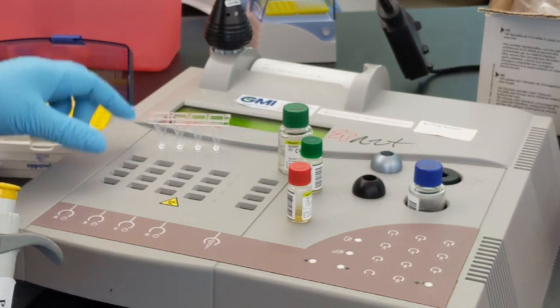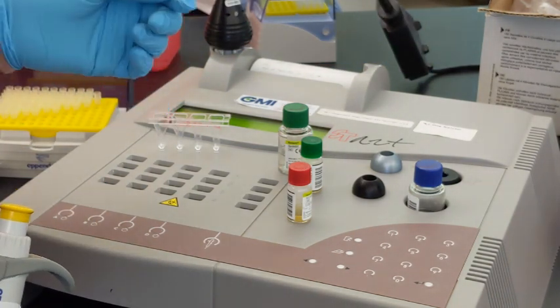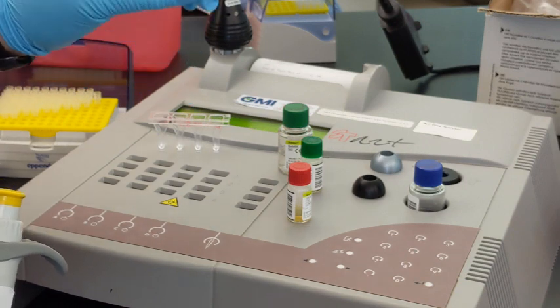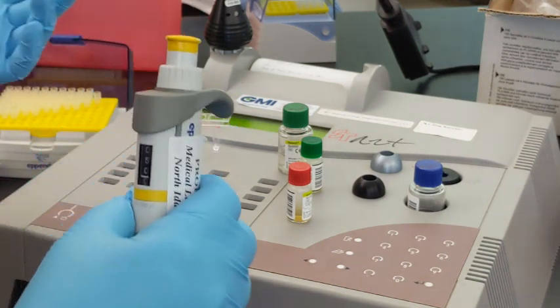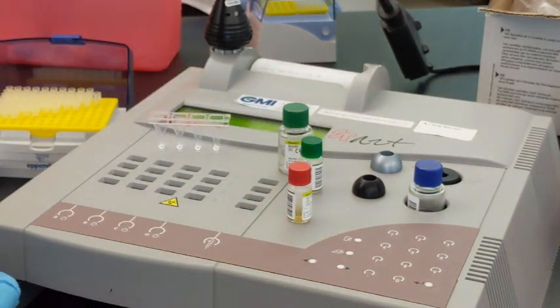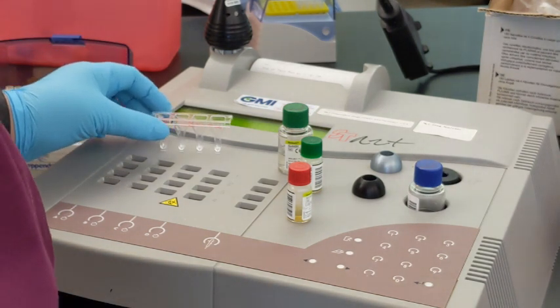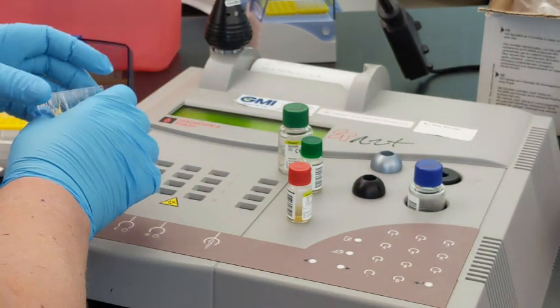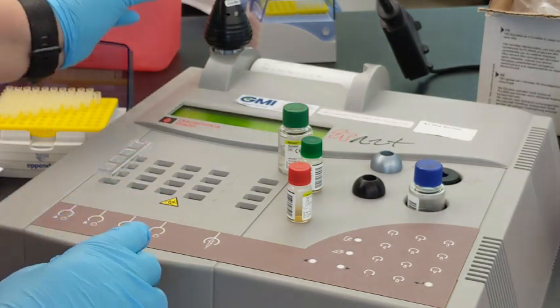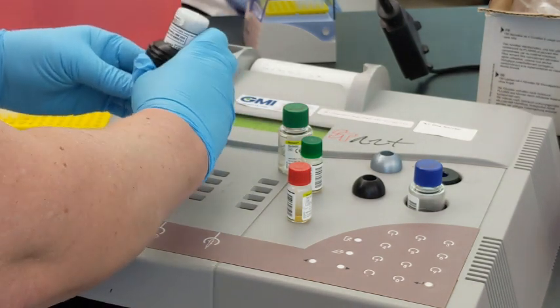So that's a difference. And then we're going to be adding our calcium chloride, which is returning the calcium into the system so that in our sample we can get a clot. Because during the collection of our light blue top tube, we removed the calcium to prevent the initial clotting. So we're going to go ahead and put the cuvette into its heating area. We're going to go ahead and add one of those metal beads into each of the cuvettes.